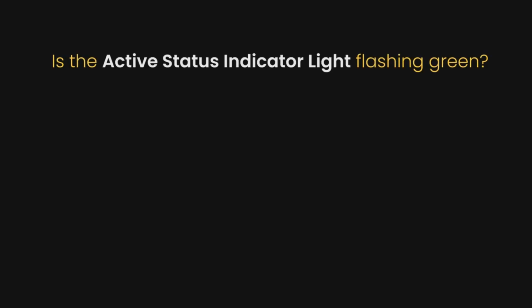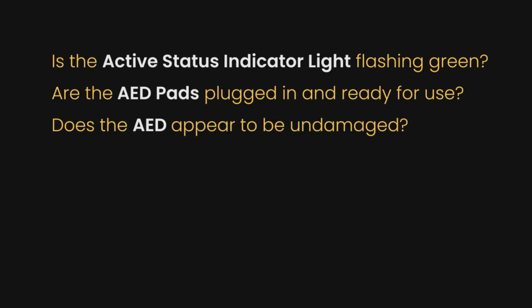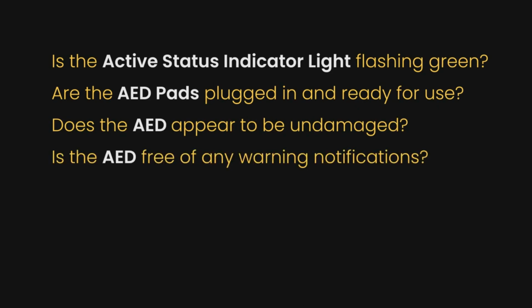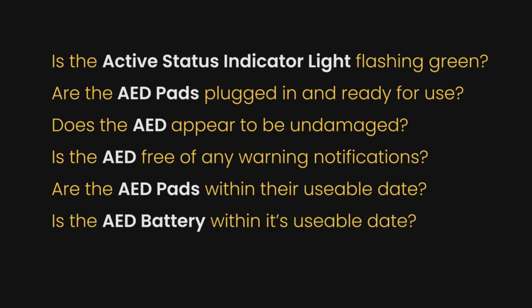We suggest checking the AED at least once a month. Here are some things you should look for when checking the AED. Is the active status indicator light on the AED flashing green? Are the AED pads plugged in and ready for use? Does the AED appear to be undamaged and ready for use? Is the AED free of chirping and other warning notifications? Are the AED pads within their usable date? Is the AED battery within its usable date? If you answer no to any of these questions, please give us a call at Defibtech as soon as possible.